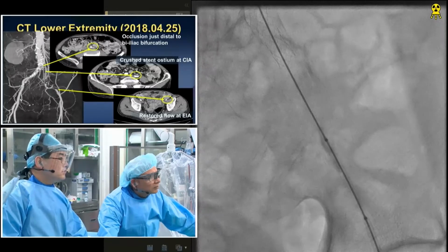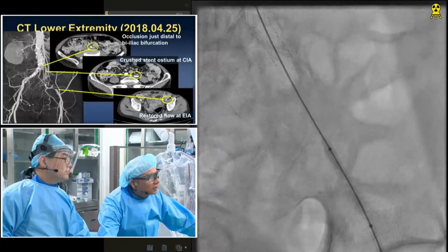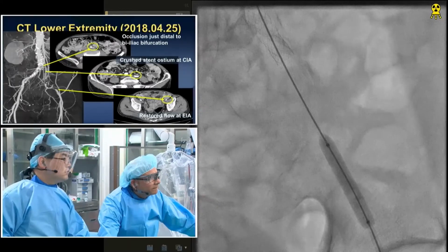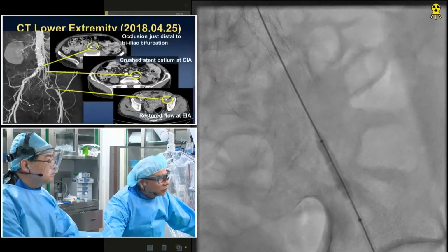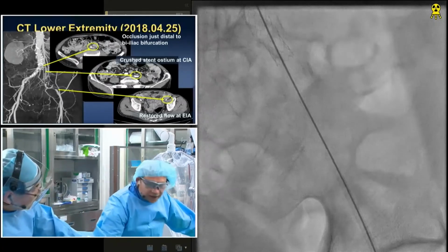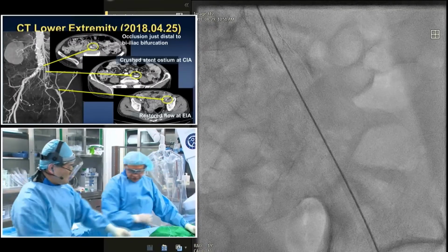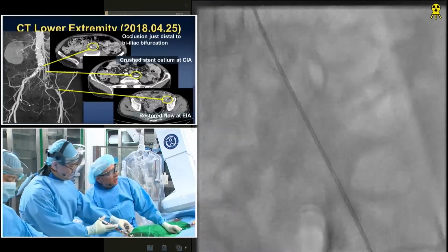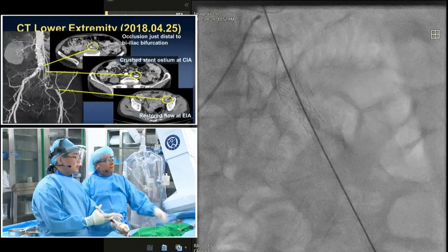The external iliac on your retrograde sheathgram was relatively small. I'm sure it's underperfused and in reality is larger, but I'm typically pretty careful down here not to overdilate, since it's been underperfused for quite a long time. As you said, it is often underperfused, but we did look at a CT scan with a view to getting some idea of the diameters we may need. The 7 mm balloon is also an indication of what size stents we may consider placing in both the common and the external iliac artery. Good. We will be planning to use 2 different size stents.